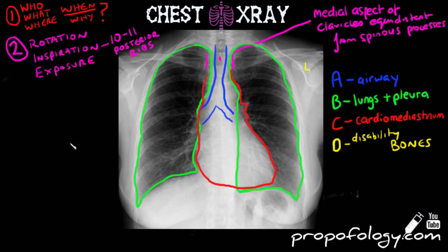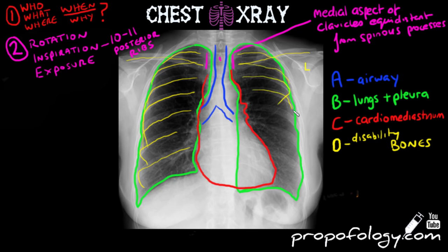Staying true to our ABCDE mnemonic, D stands for disability, which incorporates bones. You're going to try to trace the clavicles, look at the spinous processes in the midline, and then work through the ribs. Start at the top and work your way down, beginning at the posterior aspect of the ribs and working forward, looking for fractures or any displacement in all of these bones. Any fracture or displacement could imply damage to underlying structures.